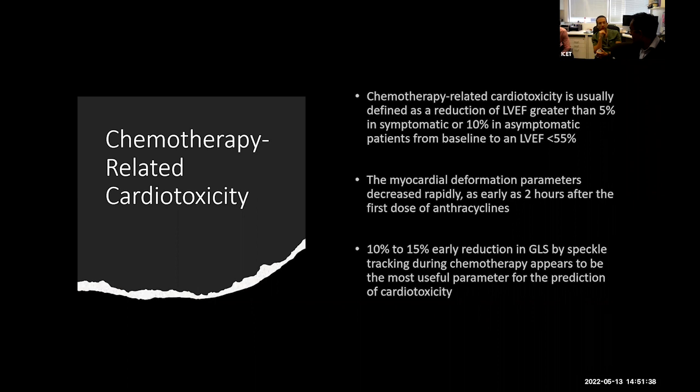And do you do RV free wall strain as well as part of routine practice? RV free wall strain is not usually part of routine practice, but if, for example, I'm looking at pulmonary hypertension, or I've got a pulmonary hypertension clinic, that would be routine practice in that circumstance. Yeah, cool. Thanks.